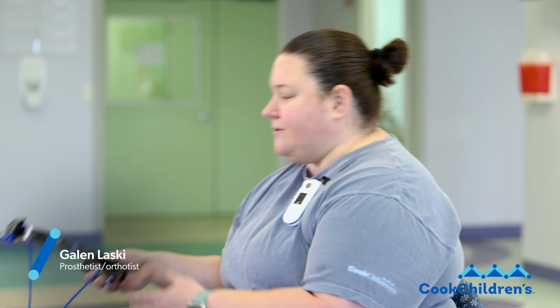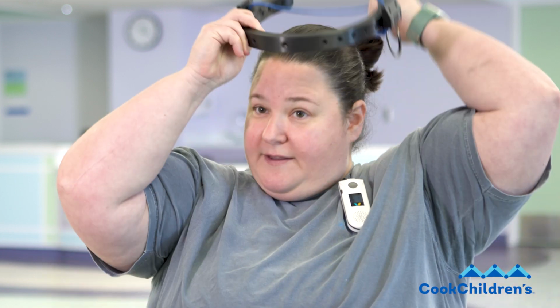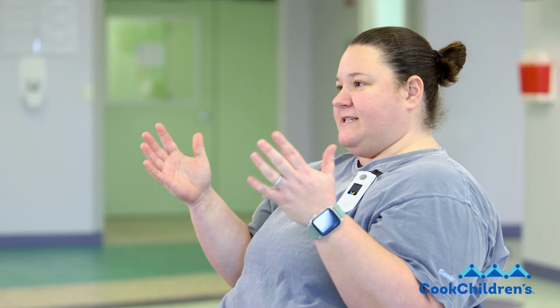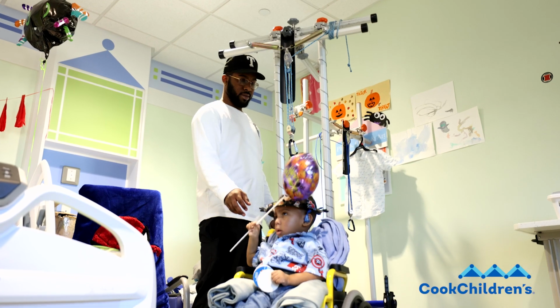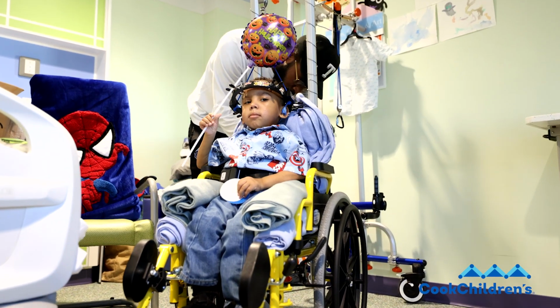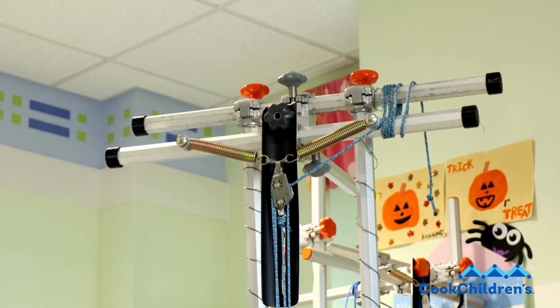My role with halo patients is I go into the OR and actually put on an actual ring onto the patient with the doctors. So we would take a device like this and we would place it on the head and put all of the pins in under anesthesia. The halo system works as kind of its own trapeze set. Traditionally it was with weights that would come over with a pulley system on the top and back of a trapeze. Now we use springs to create the tension rather than weights.